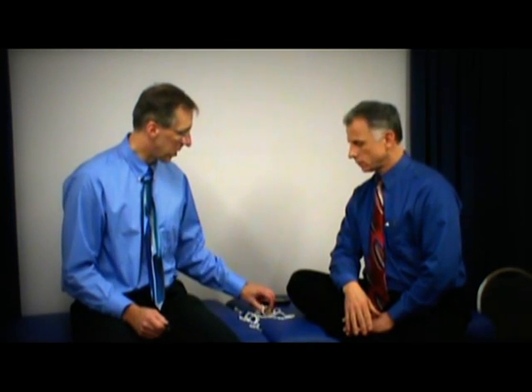Today we're going to show you how to make a pulley system. And the reason you're going to want to do this is if you're having trouble with your shoulder. We give out a lot of these. There's a couple ways we can do this. One, we actually just go ahead and give people a pulley system. And the reason we do that, we get them from China. They're kind of a cheap pulley system.